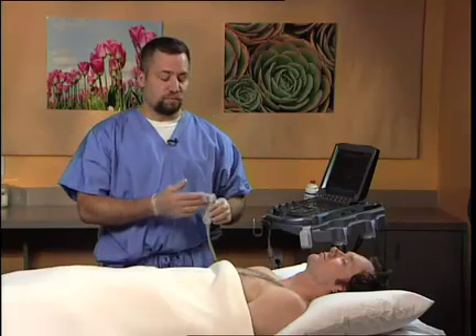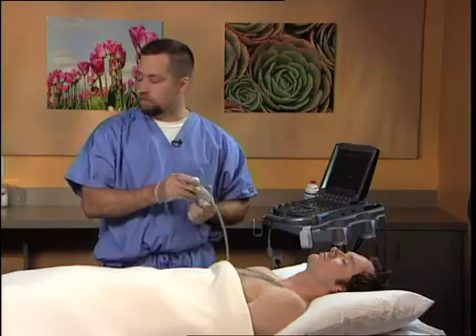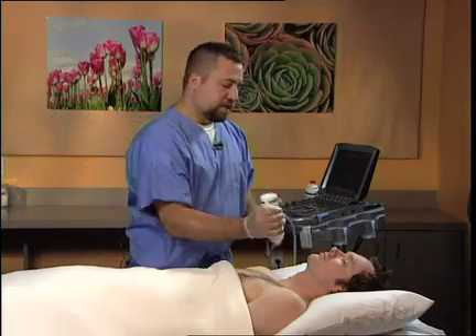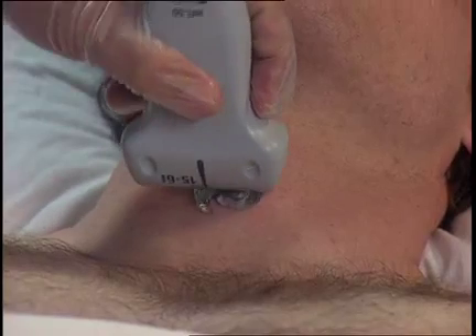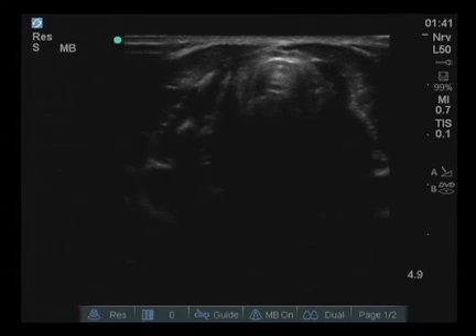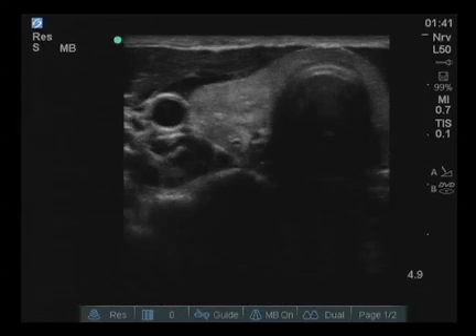In this case, the HFL50 probe will be utilized. It provides a very high-definition, high-resolution view of the subcutaneous structures. Gel is placed at the formerly marked C6 level and the HFL50 probe is placed on the skin in a transverse arrangement. The initial view is of the cricoid cartilage and then the probe is moved slightly cephalad and then rotated slightly outward.